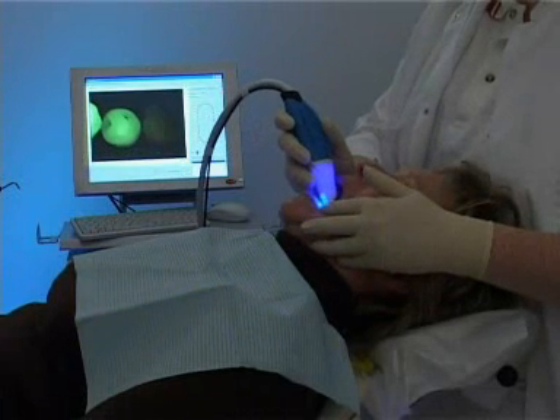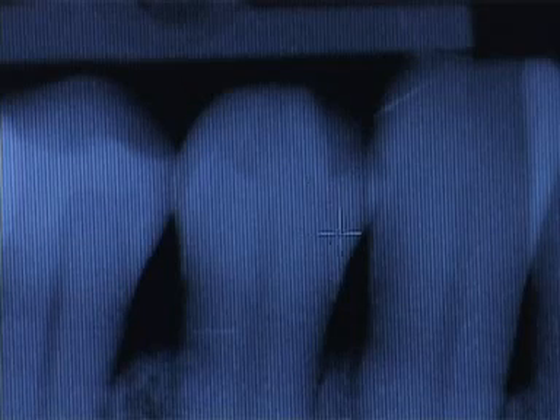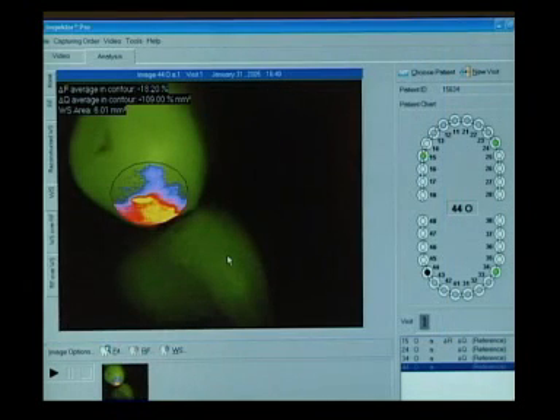QLF has shown this molar to have a white spot. With the naked eye, only a discoloration of the enamel is seen, and the x-ray also shows no specific problems. With QLF, it takes only a few seconds to realize that this element needs attention in order to avoid future cavitation.